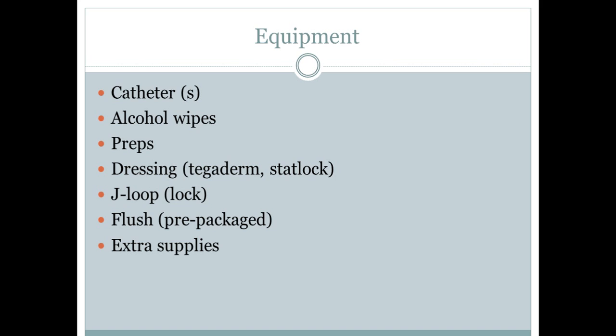Again, always remember that your saline flush, according to expanded scope, has to be prepackaged, whether already in a syringe, in a plastic bag, or prepackaged and labeled from the pharmacist or RN. It does have to be properly labeled for you to use it. The second thing you're able to flush with, depending on your facility policy, is heparin. Not all places use heparin.